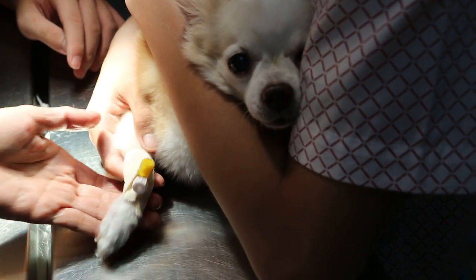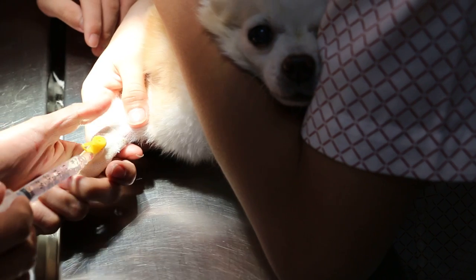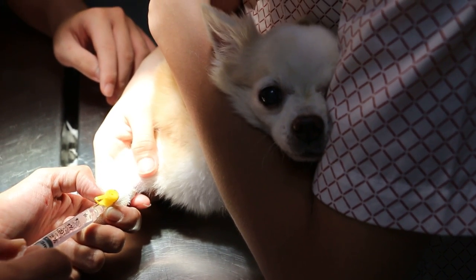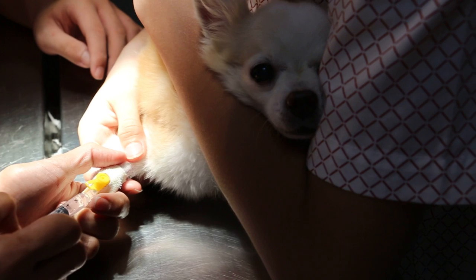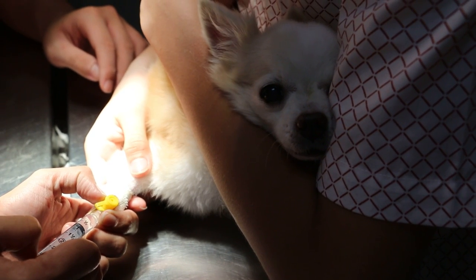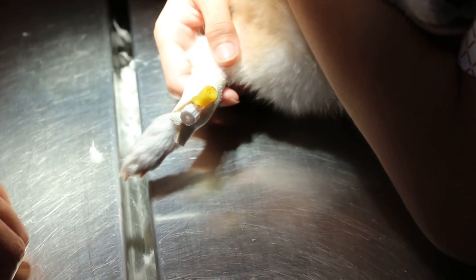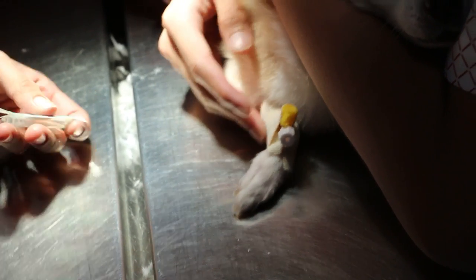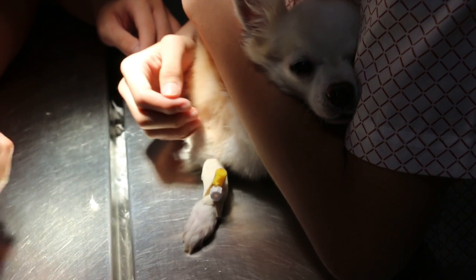Now this dog is 16 years old — which you can't believe because she really looks very good but very thin. This dog came on heat one month ago, which is very unusual because normally old dogs don't come on heat, but only one day according to the owner. So this vomiting and diarrhea could be associated with the kidney or uterine infection, which we'll only know from the blood test. The blood test will show if total white cell count goes up. In the meantime we just prevent dehydration and hypoglycemia by giving the IV. We can do again tomorrow if necessary.